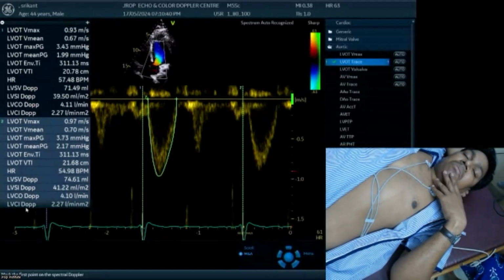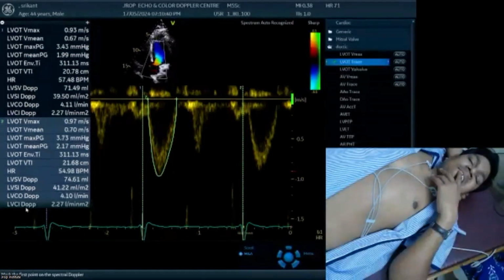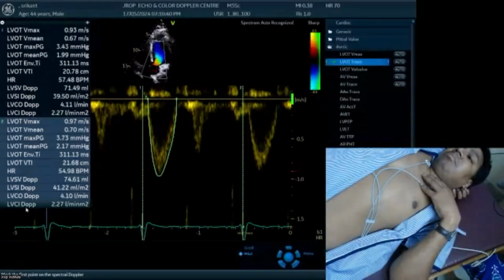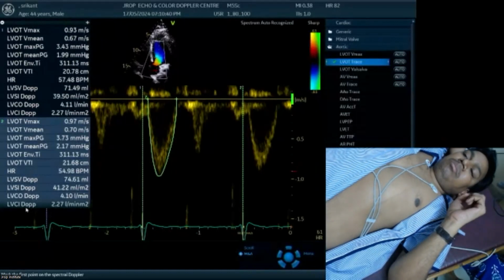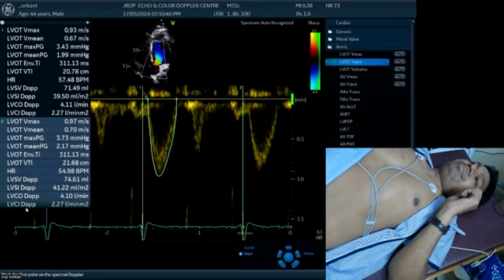The only thing is you have to switch them on by your vendor. Look, this is how we need to switch them on. And in hemodynamics, there's nothing else. You have to look at the peak velocity, velocity time integral, and pressure half time. Is that correct? I know these basics are very important, but basics are very confusing. Both the things happen together.